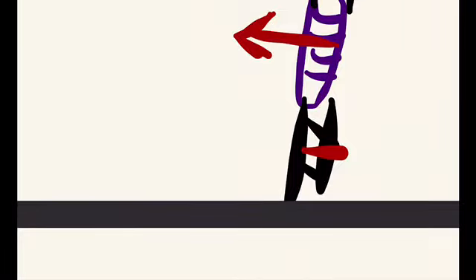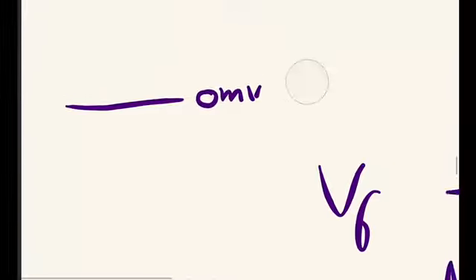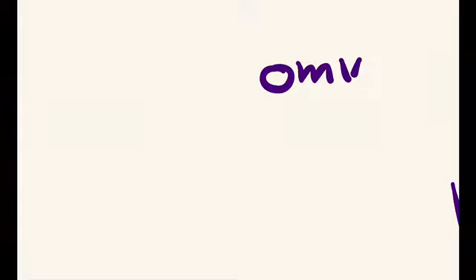That means this baseline will not be at 0 millivolt. It will be lower than that. You got my point? This was the very basic concept behind the ST segment.